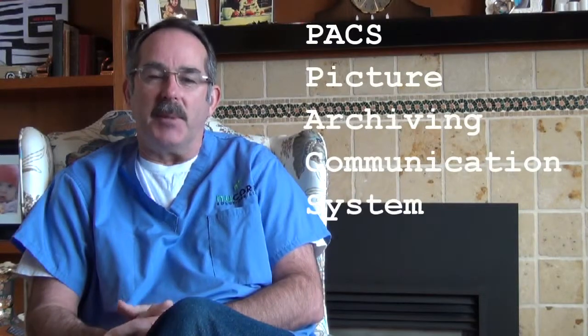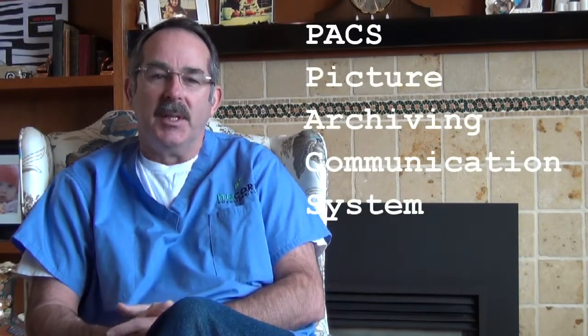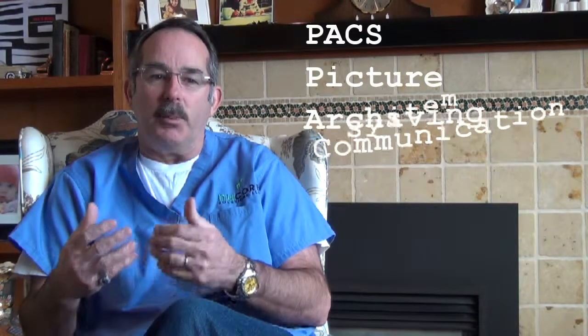PACS stands for Picture Archiving Communication System. It's an acronym that the medical community has established to utilize a format universally so that everybody that's producing digital images, be they created through a CT, an MRI, ultrasound, or whatever, those images can be transmitted, stored, and accessed either locally or by remote sites.